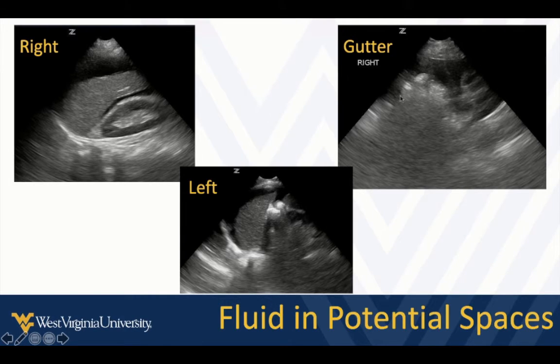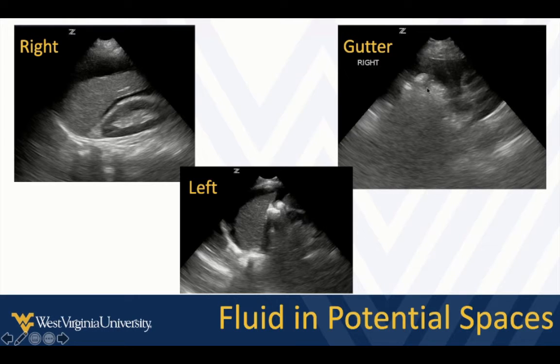On the left side, we see sub-diaphragmatic fluid, but we don't really see fluid between the spleen and the kidney. This is your money area to look for on the left side for free fluid. Make sure you include the paracolic gutters when examining for free fluid. Come down below the kidneys, fan to the ceiling, and look for fluid on your screen — it's going to look like fluid compressing the bowel down and out of the way. That's what it looks like in the upper and mid abdomen.